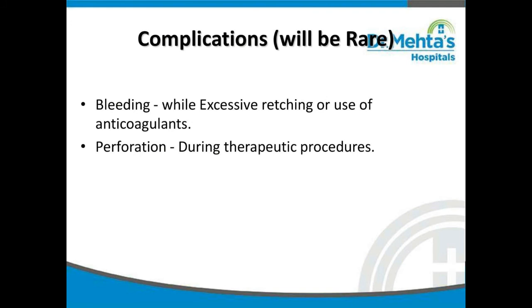Complications, though rare, are bleeding and perforation. Patient may have bleeding while excessive retching or use of any anticoagulants, and perforation may occur during therapeutic procedures.